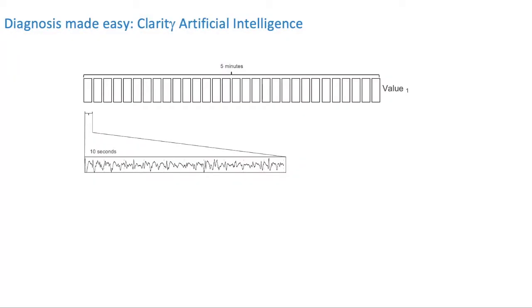It's an AI-based algorithm that cuts the last 5 minutes of EEG into 10-second segments. It has been taught to recognize at least 52 features of the signal to be associated with seizures. And then the algorithm uses these features to determine if any of these bins contains seizure. These seizure-no seizure outputs will then be averaged over a 5-minute long window of EEG.